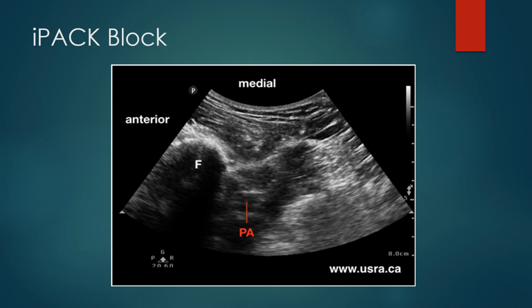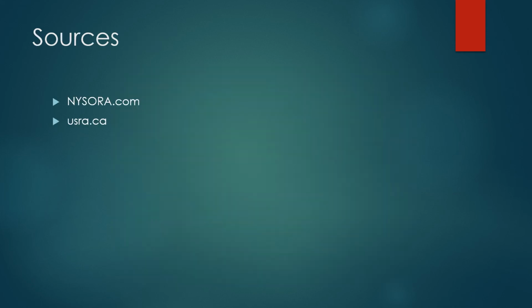Frequently, you'll see the popliteal artery moving away from the femur, and that's a good sign. Of course, we have to be very careful and identify where the vessels are. Small vessels can be difficult to see here, so it's very important to inject in small gradations and to aspirate frequently.